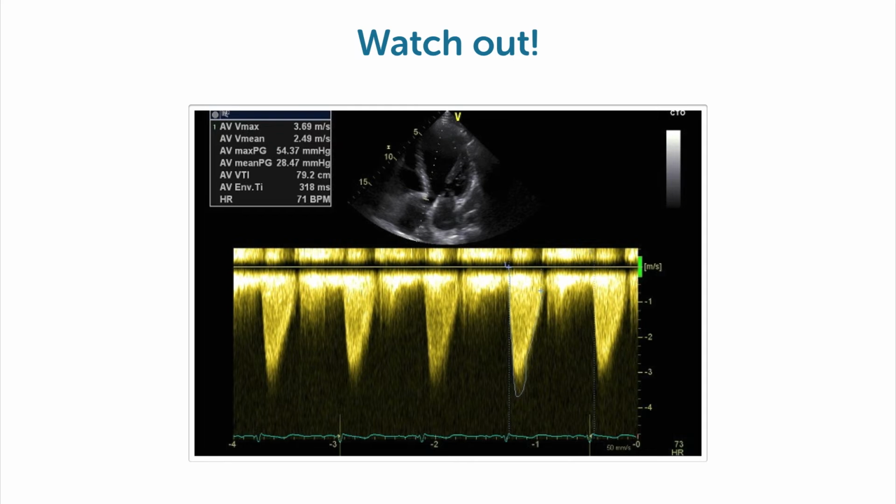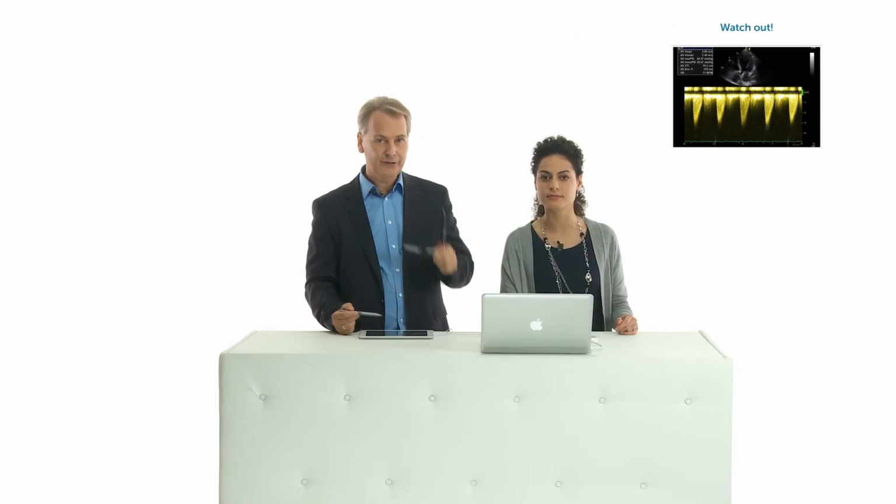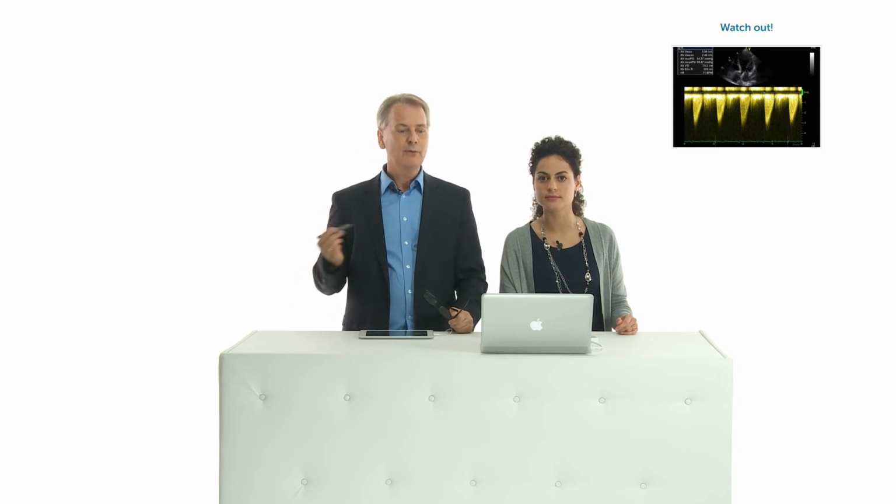Yes, and if we now look at the continuous wave Doppler signal across the aortic valve, what we see is that the patient not only has aortic regurgitation, but also flow acceleration through the valve, which means there is some degree of aortic stenosis. However, watch out, because with aortic regurgitation, as we mentioned previously, we probably overestimate the severity for AS.